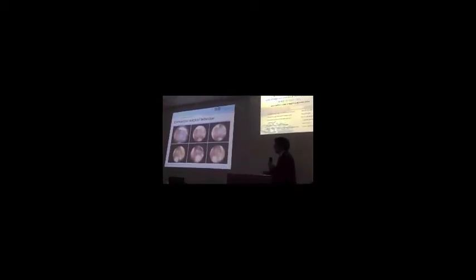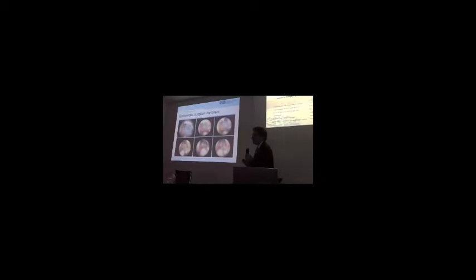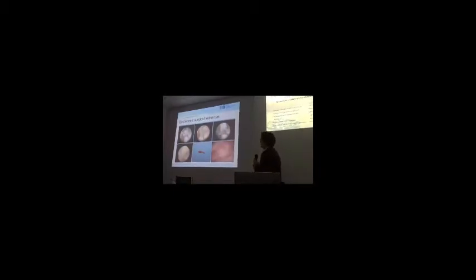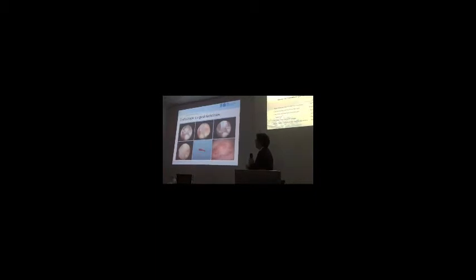The most important thing is to detach the lesion from the vessels, and sometimes this is very difficult, sometimes it's very easy. So sometimes you can really cut the lesion from the attachment, but it's not always the case. So this is a typical one here. You can then cut it if it comes out nicely like this.